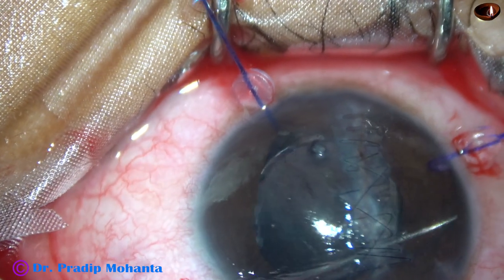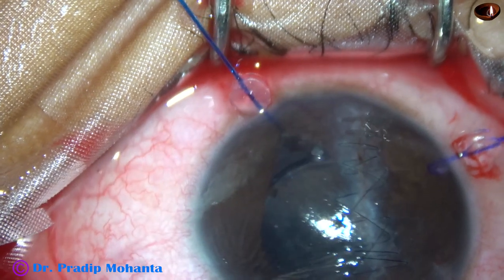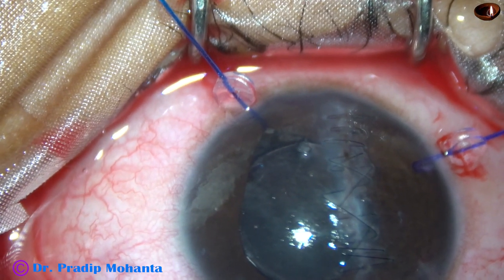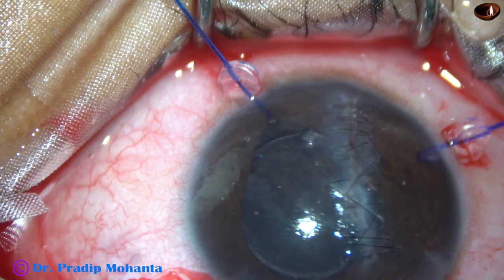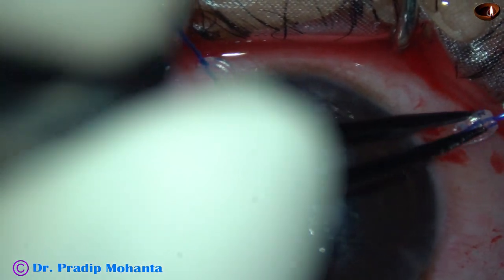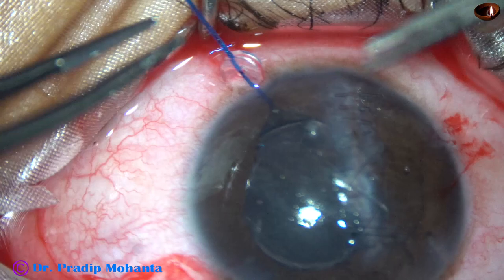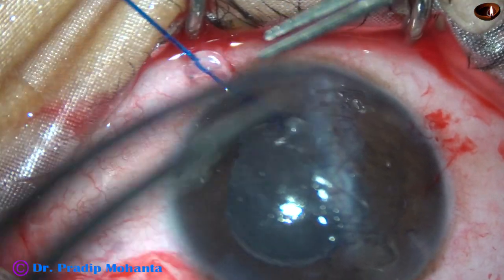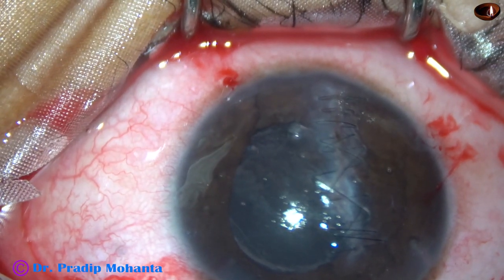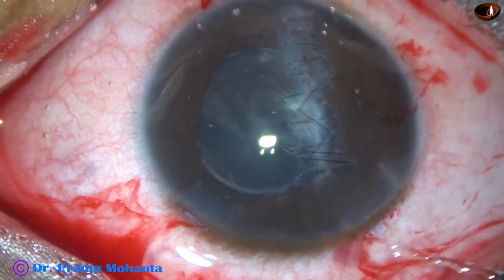Now I go through the side port with the Sinski fork, pull the haptic, and place it at 11 to 10 o'clock. The lens is nicely placed in the sulcus. I inject visco, and now the iris retractors are removed — one is removed and then the other. I retract the silicone guard, unhook the pupillary margin, and then remove the iris hook. Visco cleaning is then done thoroughly.